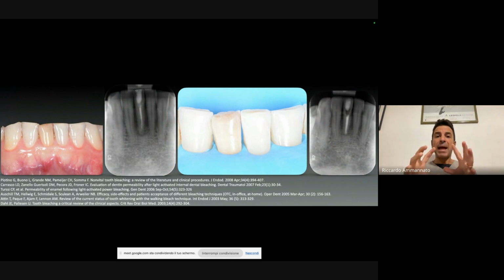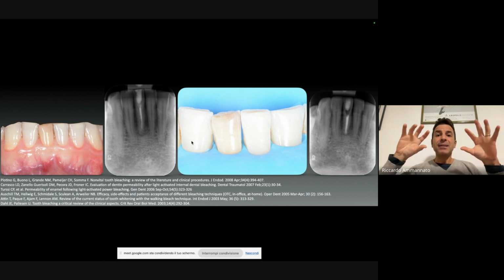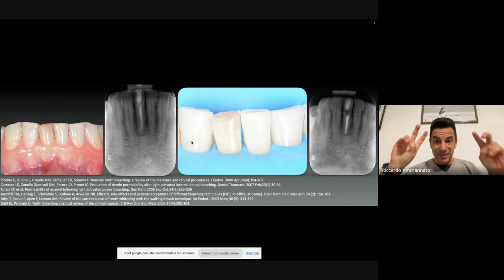We need to manage also the anterior area, all opening up the vertical, no prep. So again, the project is from lateral to lateral. Okay, I will do my index technique procedure. So I'm going to do a no prep procedure, and also from lateral to lateral on the upper, the same, while on the 4 canines, I will cement the Emax veneers, and we will see later.